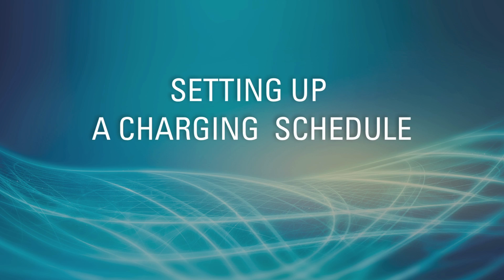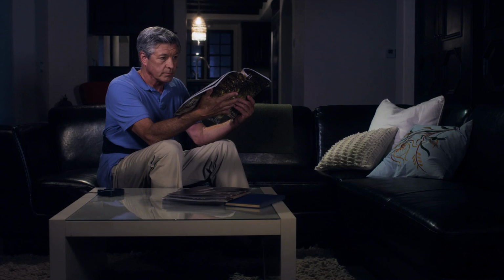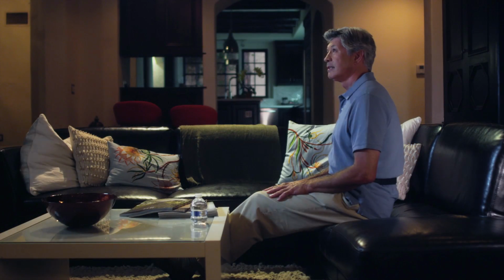Setting up a charging schedule. Boston Scientific recommends that you follow any recharging routine that fits your schedule and lifestyle. Just be sure that the stimulator keeps a sufficient charge to do its job without interruption. Because each person is different, the amount of time needed to spend on charging depends on how much power you have used since your last charge.